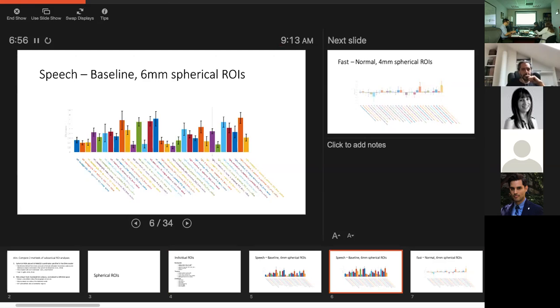Okay, that's good to know. Because in my head, I was like, oh, it's ROI analysis and it's smoothing, but when you explain it, it makes sense. Yeah, even when we automatically label the cortex for each individual, you probably still want to do some smoothing because we're not going in and correcting it. If you were using the FreeSurfer subcortical ROIs, those are probably accurate enough that maybe you wouldn't want to smooth, or smooth just a little bit. Yeah.